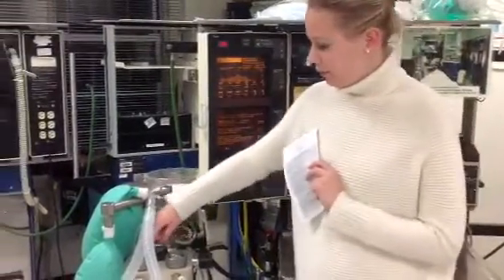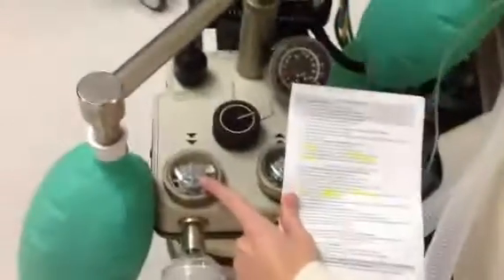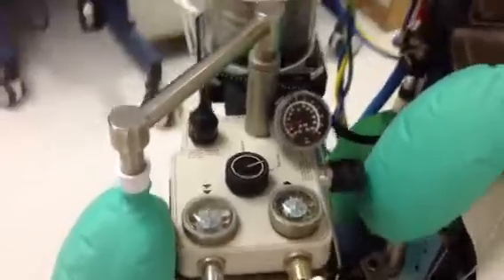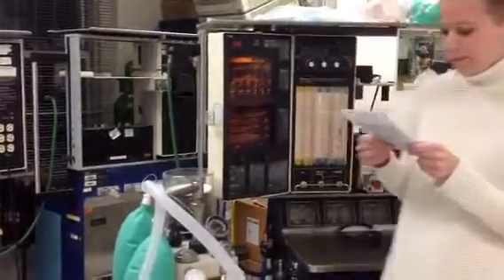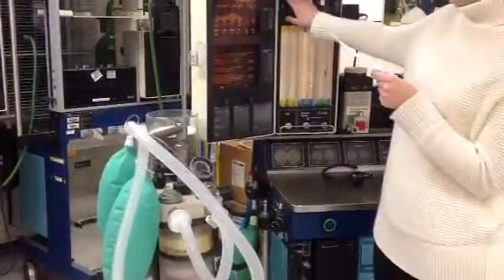Check the unidirectional valves. During exhalation, this one moves. During inspiration, this one moves. And then exercise breathing circuit accessories like PEEP and whatnot for proper function. Turn ventilator off.